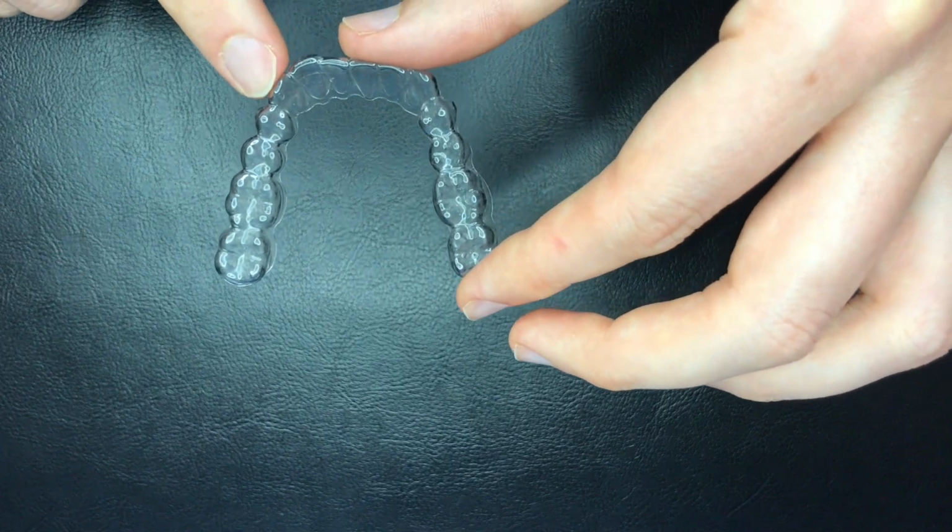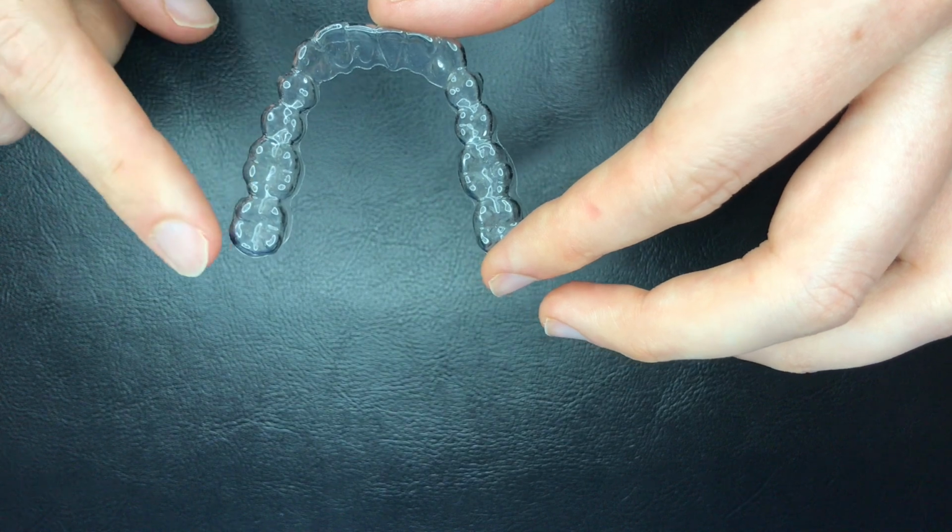The downside with Essex retainers is now and then you will see patients who continuously grind through these. It's worthwhile inspecting your retainers intermittently for signs of early wear. Those include what we call faceting around the canines, which is the pointy eye teeth, and also small cracks or opacities, that's where the acrylic goes less clear, around the back teeth or molars. Those are early signs of wear in your retainers. If you notice those, or perhaps more wear than that, keep us informed of course.